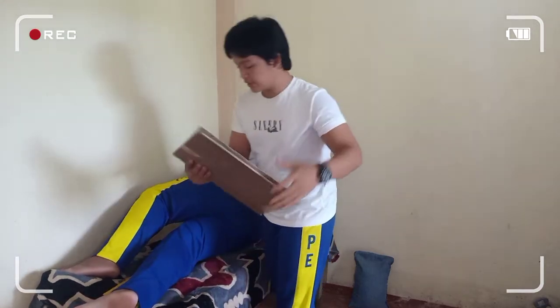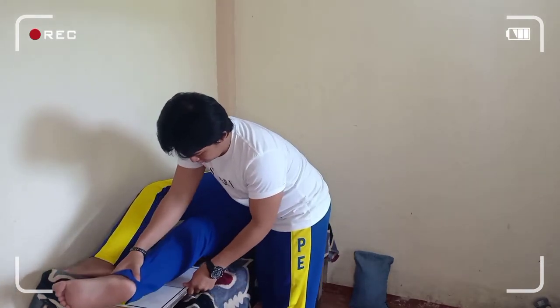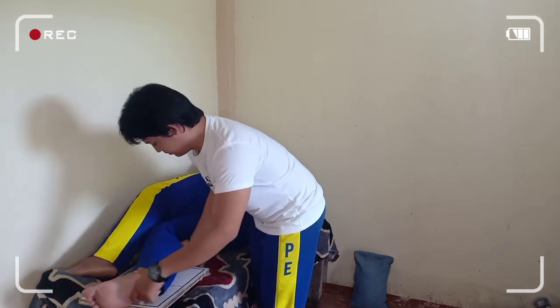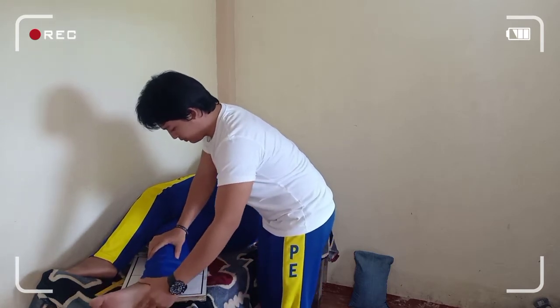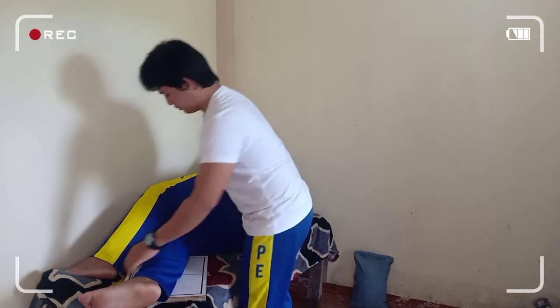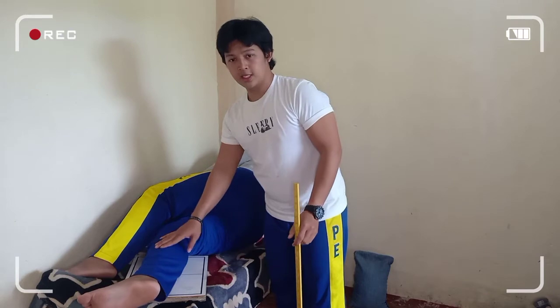So guys, the image receptor must be in the mid leg. Ganito yung ating position ng ating lateral.